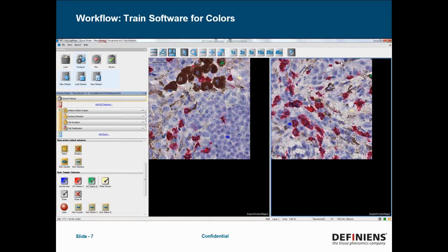The next step is to train the software on the different chromogenic stains that are present in the image. This is new to Tissue Studio 4.0. This new section is in the general settings — it's our stain picker. What you are able to do is simply pick a paintbrush and color directly onto the image the different chromogenic stains that are present.